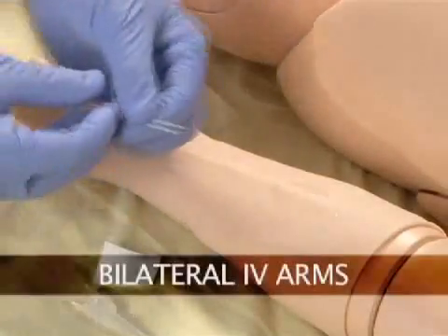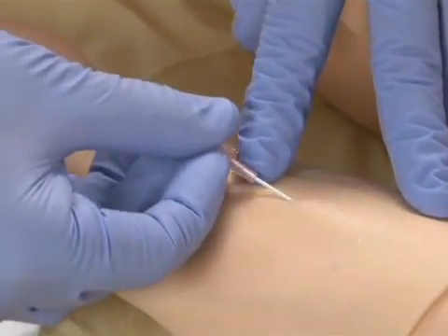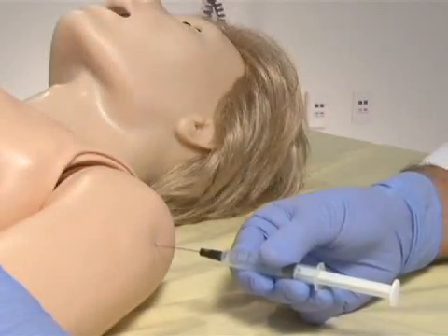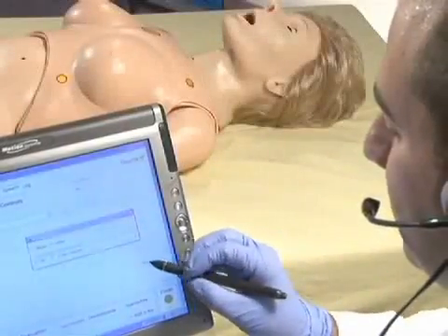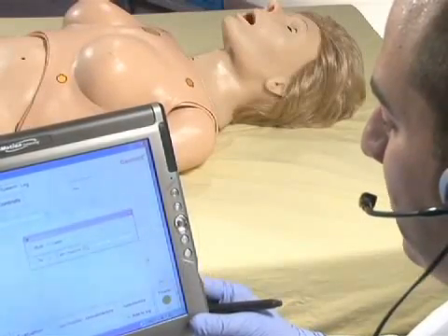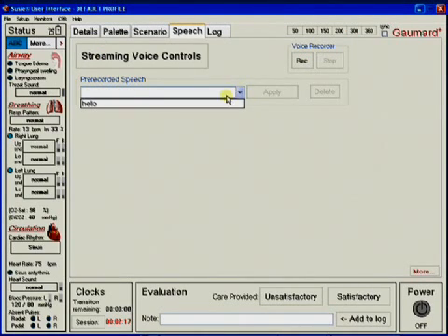Suzy has bilateral IV training arms that can be used for bolus or intravenous infusions, as well as for drawing fluids. In addition, she has IM sites on both her deltoids and quadriceps. Suzy has the capability of streaming audio, so you can be the voice of Suzy and her responses at a distance of up to 50 meters. This feature allows you to create and store vocal responses in any language, or select from a pre-recorded vocal menu.